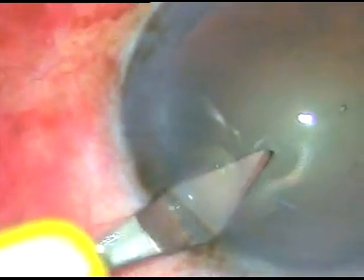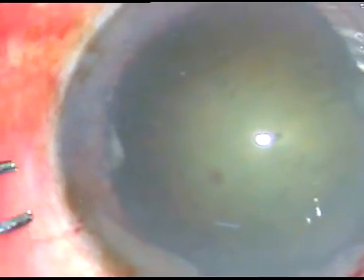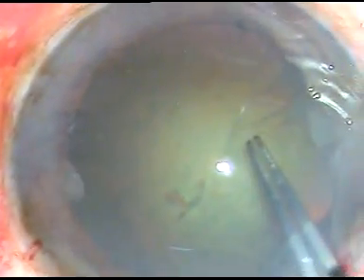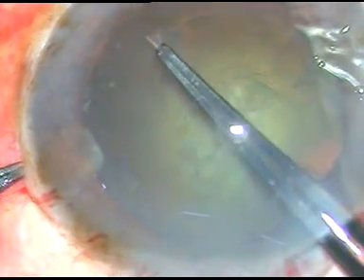This is the second case. The side port is being made and the same lance tip knife pierces the anterior capsule. Now I fix the eyeball, go with utrata forceps, hold it here. Those of us who are doing capsulorrhexis using utrata forceps can initiate rhexis in this way. This is a very good technique to initiate capsulorrhexis.